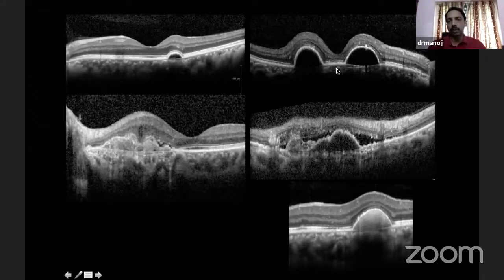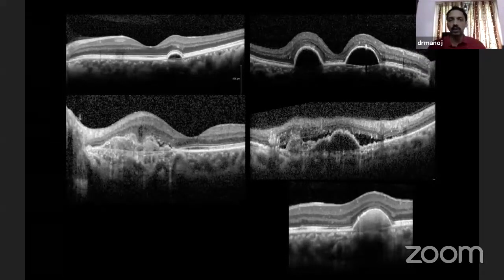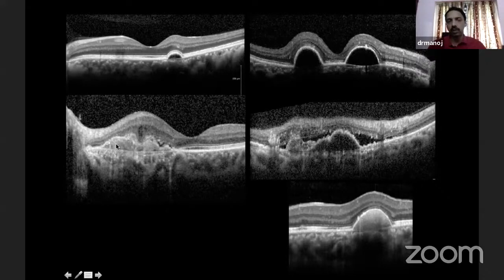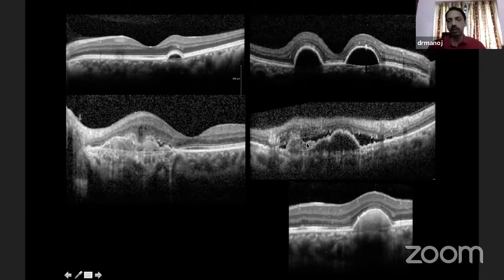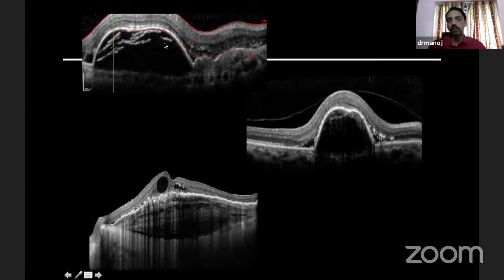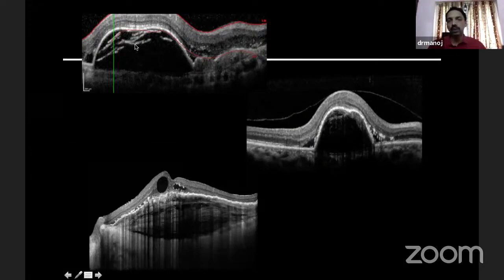Sometimes you have elevations of the retinal pigment epithelium with fluid collection — these are serous pigment epithelial detachments, commonly seen in CSR but also in age-related macular degeneration. Sometimes this area has some content with internal reflectivity within the PEDs — this is called fibrovascular PED or type 1 choroidal neovascularization. Some PEDs may have serosanguinous content with some portions having reflectivity and some not. It may contain blood, which does not allow light to pass through — this is a hemorrhagic pigment epithelial detachment. PEDs can also have layered reflectivity inside, called multi-layered PED, or laminated bodies called multi-laminated pigment epithelial detachment.